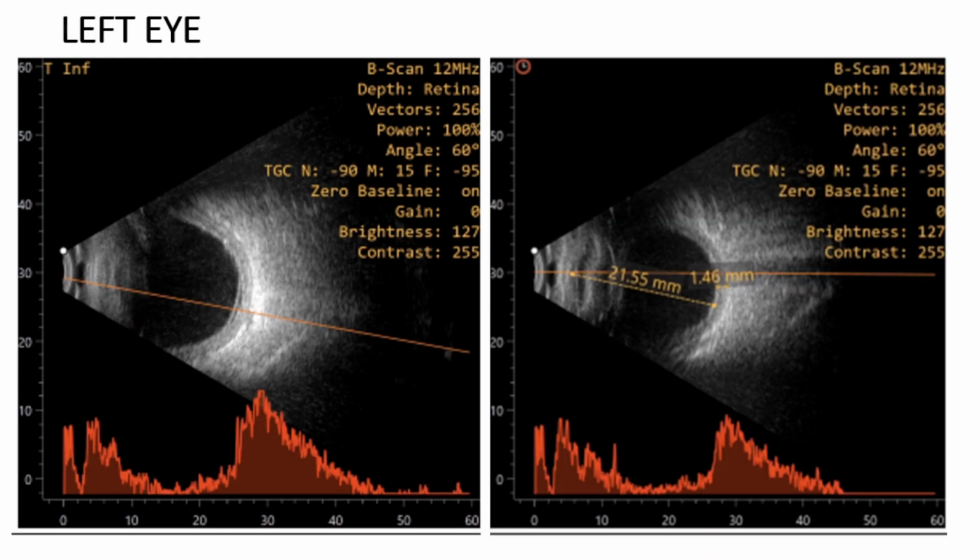The left eye showed a few dot echoes in the vitreous cavity. The axial scan is not there, so in this scan the posterior lens echo is noted. Slight retinochoroidal thickening is noted, but the retina appears to be attached. So what is it that you are seeing on the left-hand side? There is an RC elevation.